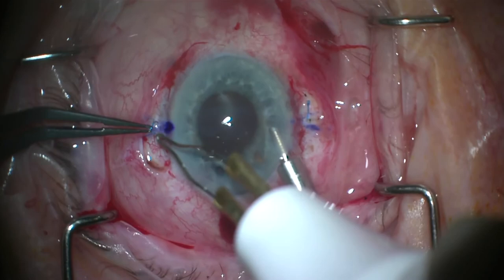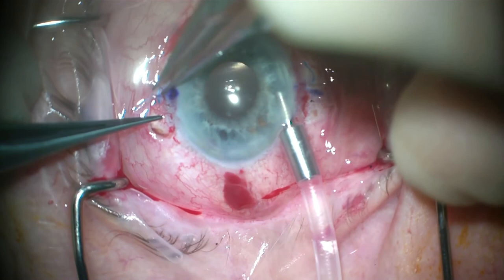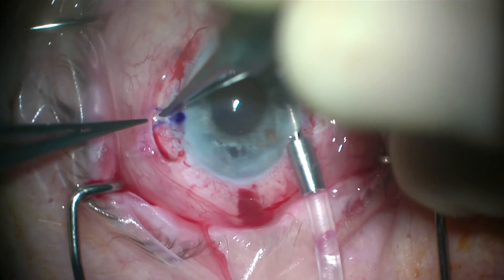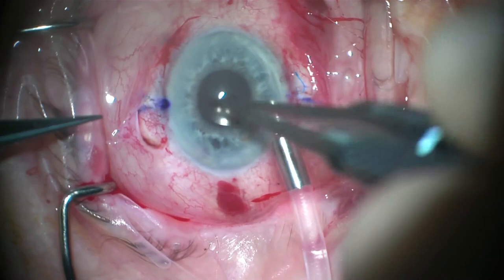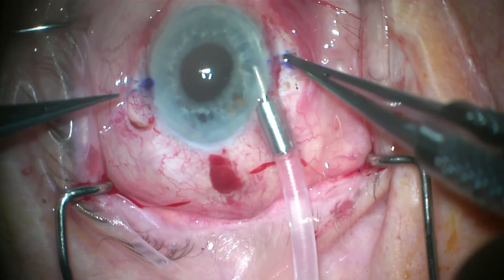Once you are happy with the position of the haptic, a flange tip is created using cautery. Ensure good IOL centration by making sure that the haptic is sitting snugly right at the most anterior part of the sclerotomy wounds — this prevents torque. Once you are happy with the position, you can internalize both tips.